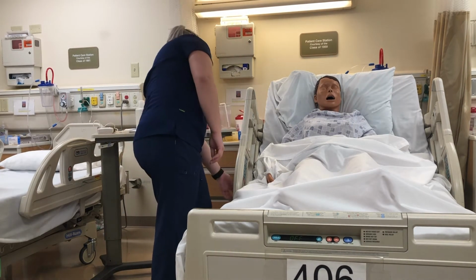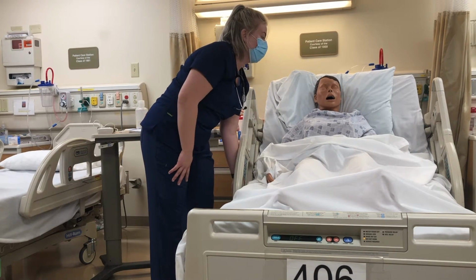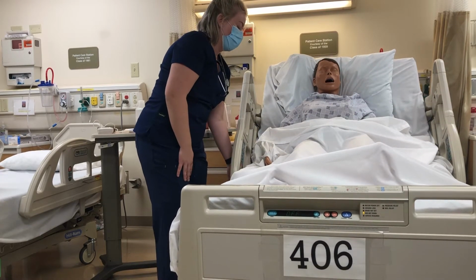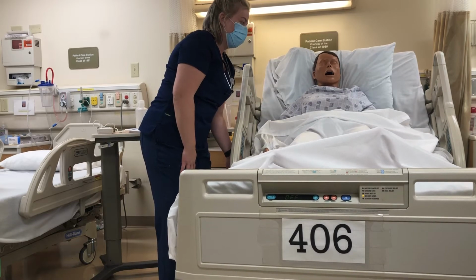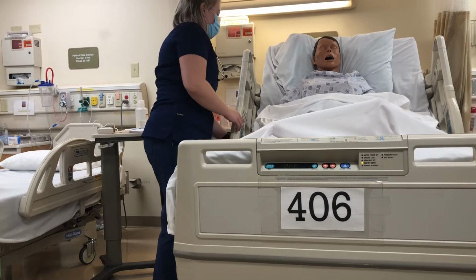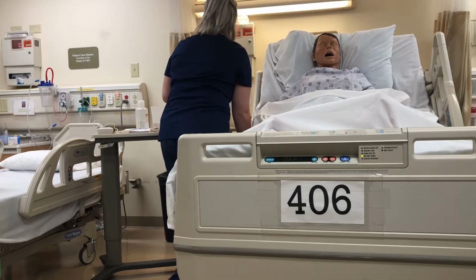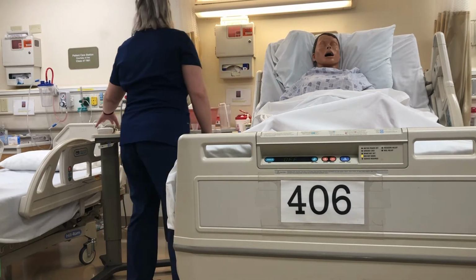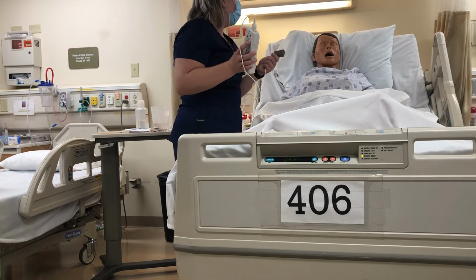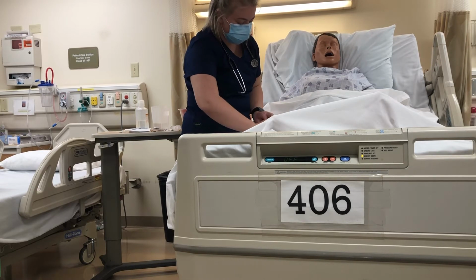Now I'm going to do a couple pre-procedural assessments. I need to listen to your bowel sounds. I need to listen to your lungs and assess your oxygen. So just bear with me here for a second and we'll get you moving. Do you have any questions thus far? No? Okay. So first I'm going to put this SpO2 machine on. It's just going to read on your fingernail and it's going to report back what your oxygen is saturating at.